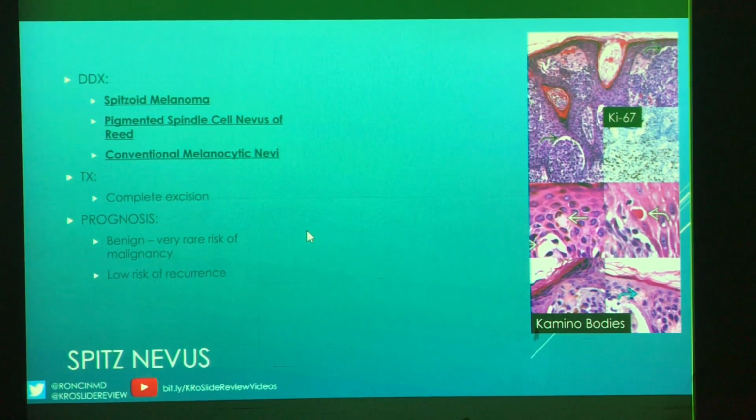Right. Of course there's variance to everything, and this is where you definitely point out that I am not a dermatopathologist. But I would imagine that it very closely resembles a Spitz nevus, but there's atypia there that is not allowable. While we were going over the details of Spitz nevus, what we didn't see is allowable atypia. So that's probably the difference.